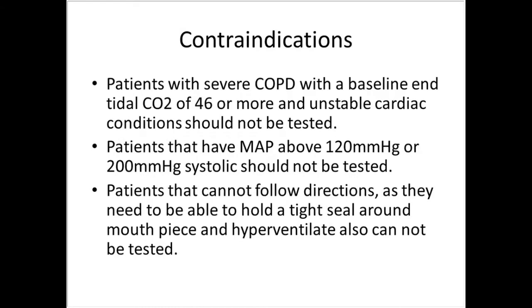So some of the contraindications for doing a CO2 exam are that if patients have severe COPD or they have a baseline end-tidal CO2 of 46 or more, or they have an unstable cardiac condition, they should not be tested. If the mean arterial pressure for the patient is above 120 or 200 systolic, the patient, again, should not be tested.